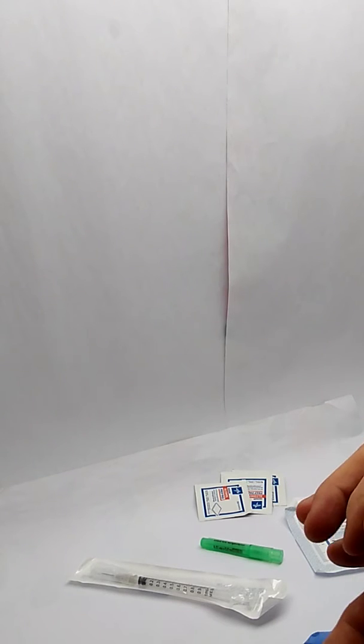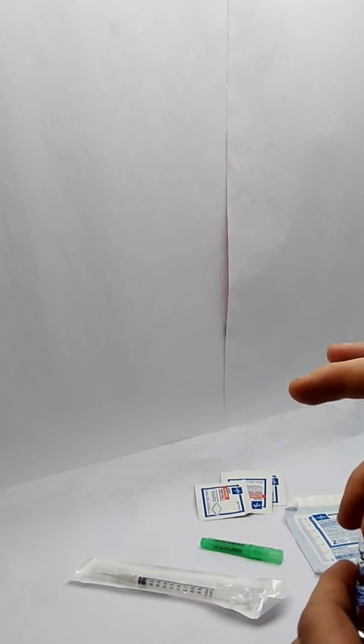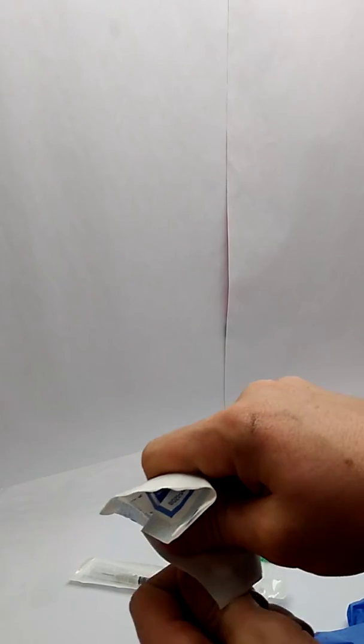Now, while holding this heparin ampule upright, I'm going to tap it to remove the medication in the top of the ampule, and I see that I've gotten that evacuated, which is great. Now I'm going to use this gauze pad, and I'm actually going to snap this off, breaking this away from my body.